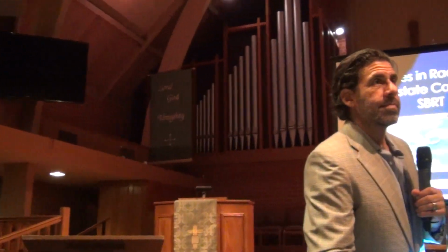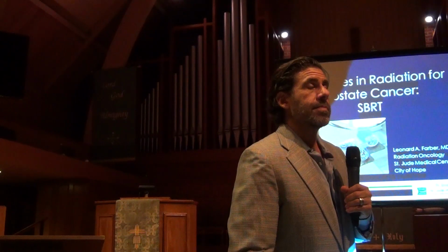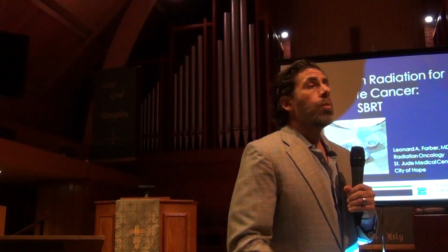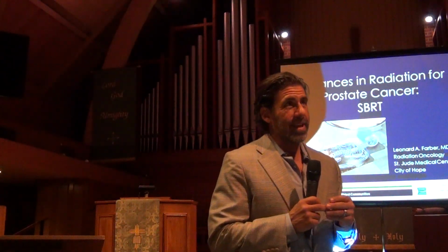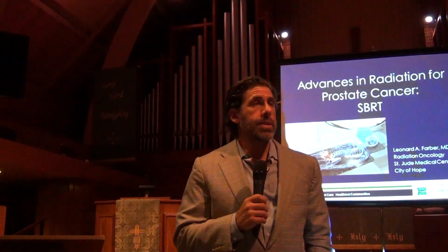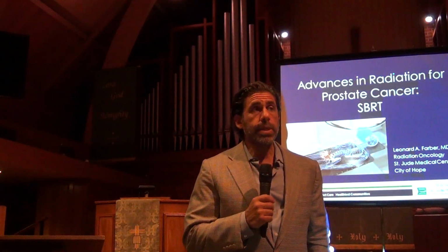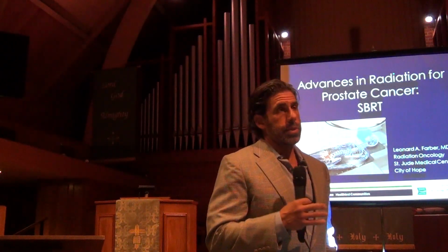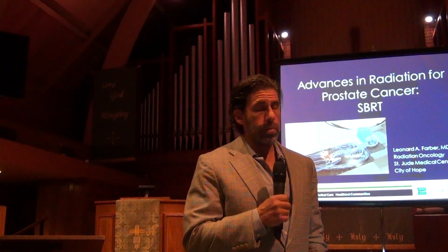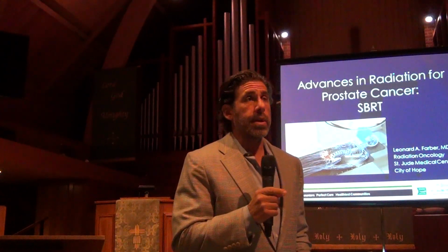What's the future for using SBRT for metastasis? Well, actually the future is here for that. For patients that have an isolated lymph node metastasis, we do SBRT. I've done this routinely on patients. As you saw, we typically treat just the prostate, unless there's disease in the lymph nodes already, and that's another scenario I'll explain.